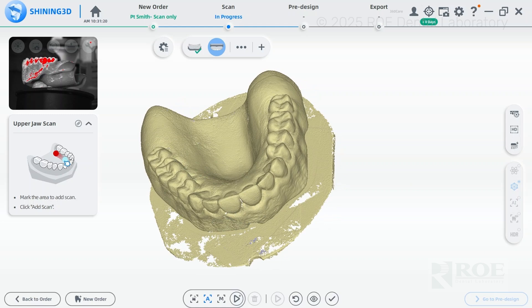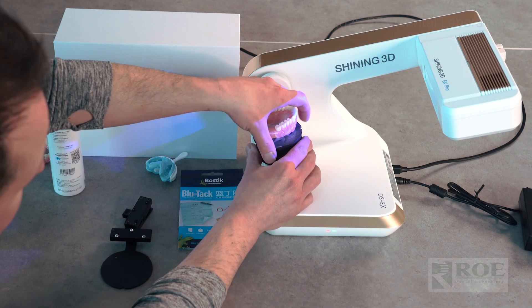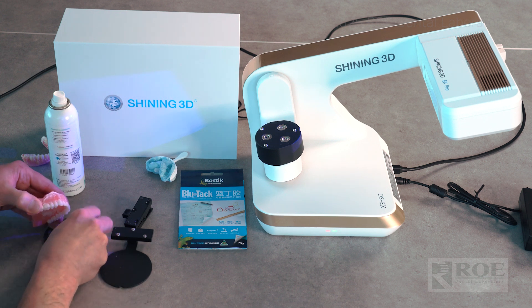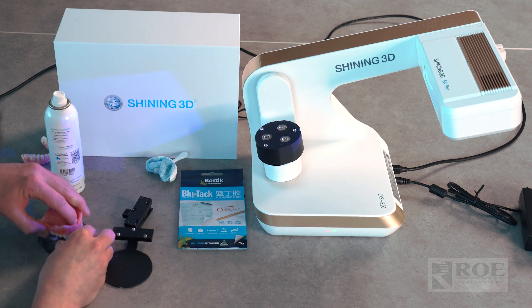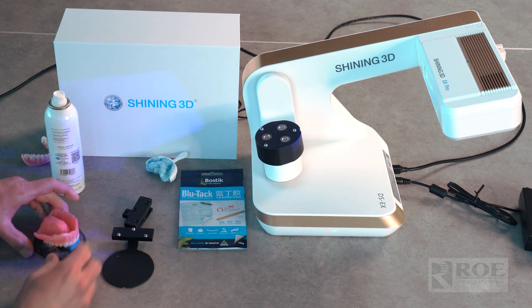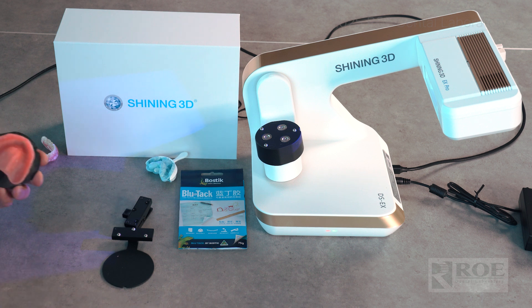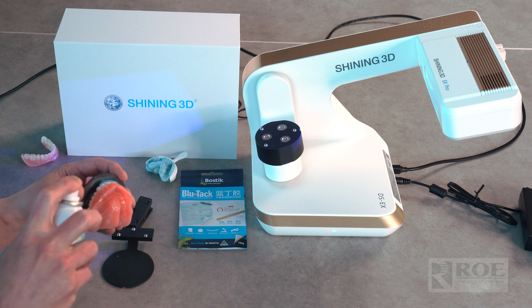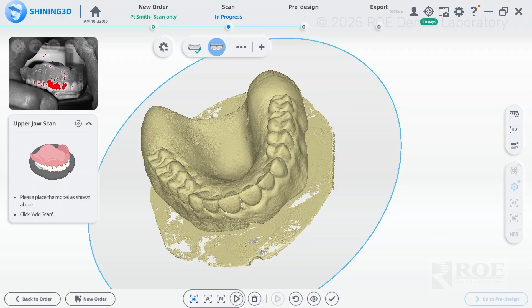Now we're going to flip it and do the intaglio surface. Take the plate off if you like — I always find it's more stable on the table. Use your blue tack again, make sure it's somewhat parallel; it's easy to cut the plate out after it's scanned. Apply the spray or powder to capture everything and get rid of all the glare. Put the notch to the notch, then push play to scan.